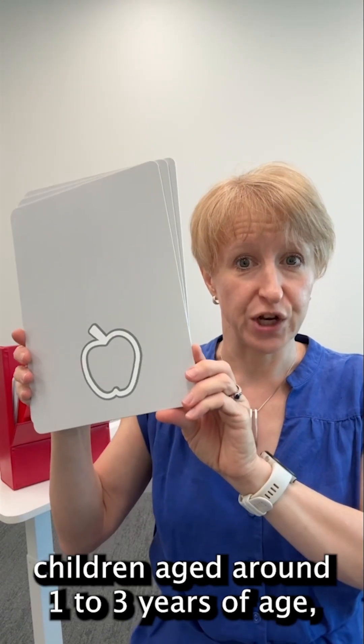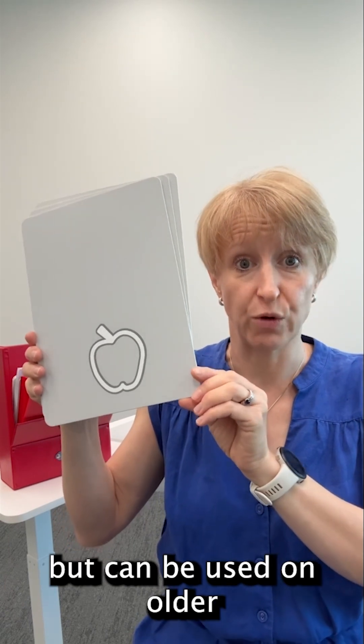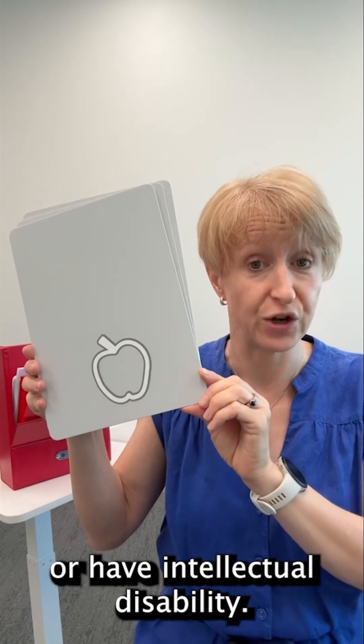This assessment is great for children aged around one to three years of age, but can be used on older children or adults who are non-speaking or minimally verbal or have intellectual disability.